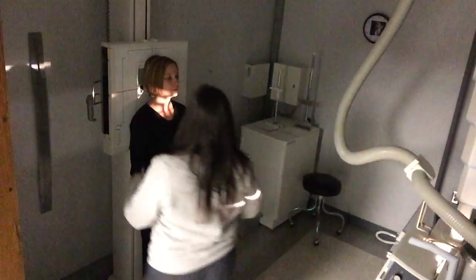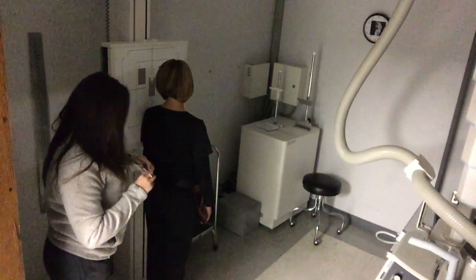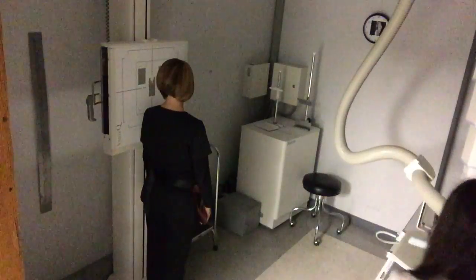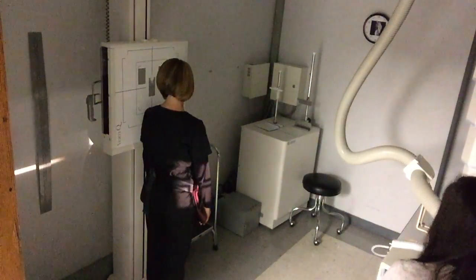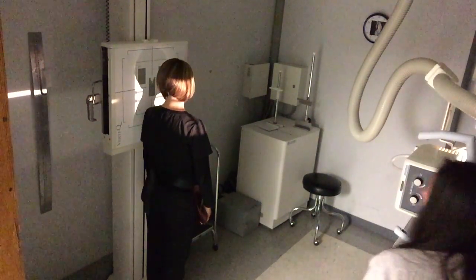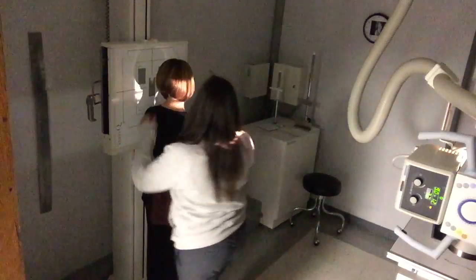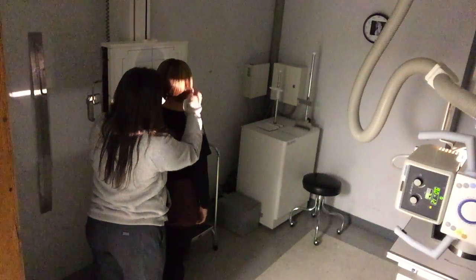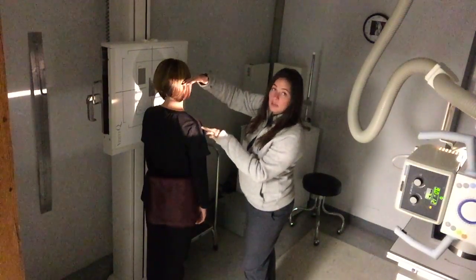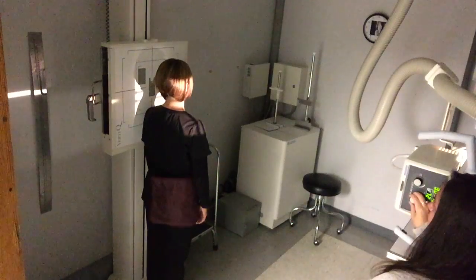The last projection is a lateral. I'm going to have her turn to the left with her left shoulder up against the board. This time I have to use my left marker, so I'm going to take the right one off before I forget. I'm also going to take the angle off my tube — we'll be horizontal, staying at 72 SID. The centering is the same: right to the middle of her neck where her Adam's apple is, at C4. I'll slide her shield around. The best way to know how to collimate top to bottom is to look at her ear — I want light just to the top of her ear and a little bit on her shoulder as well.